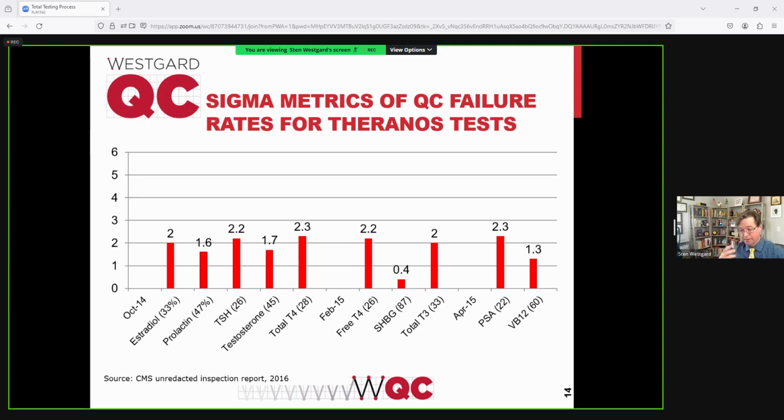Remember, some of you may not know what Theranos was, but it was a $9 billion value company. It went to 0 value. It went out of business because of these quality concerns. And 2 of their executives ended up spending, well, they are sentenced to more than 10 years at federal prisons. So having your sigma metrics down very, very low can result not only in harm to patients, but also they can put you out of business. They could put you in jail.